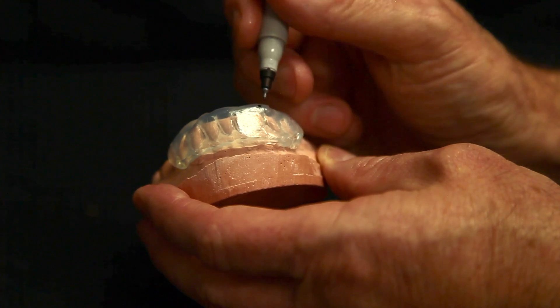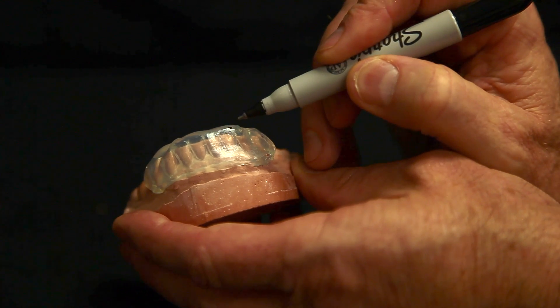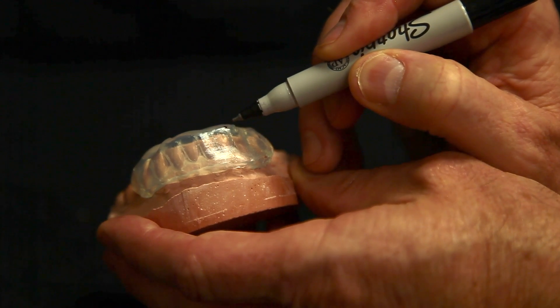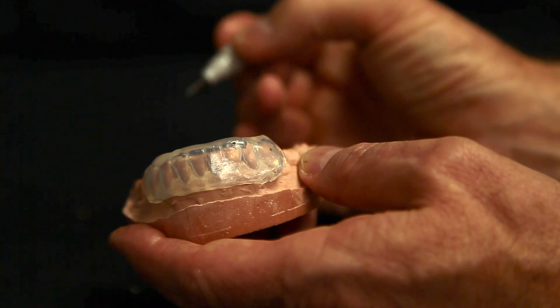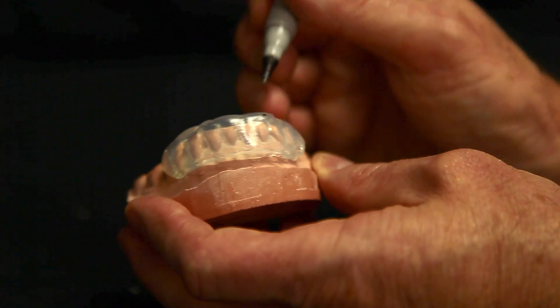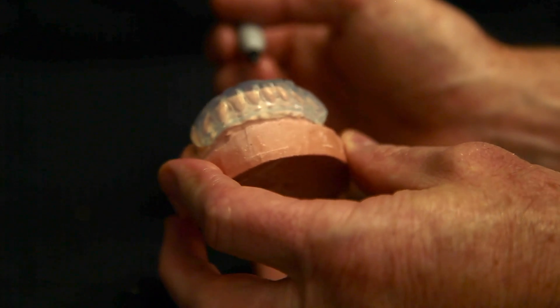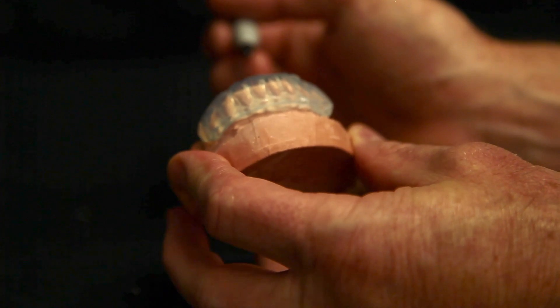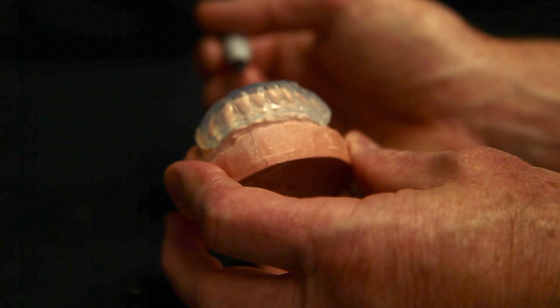And that will allow you to fill the facial and tip your composite syringe tip up a little bit and go over the incisal and it'll wrap onto the lingual, usually without a problem. So plan your pilot holes wisely and it'll minimize your work and keep your occlusion accurate during the transfer process.